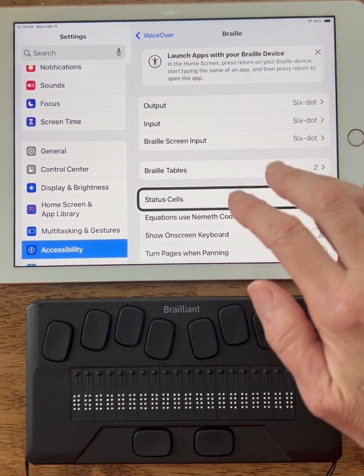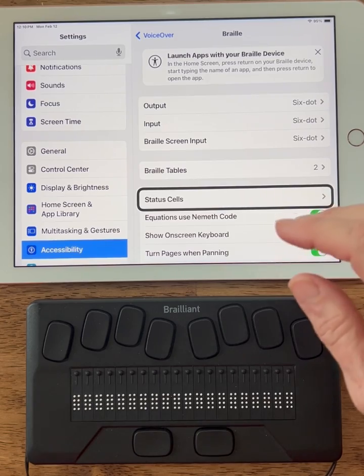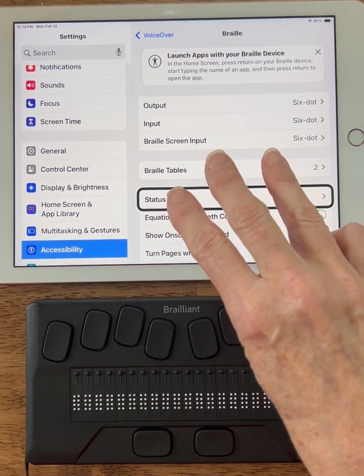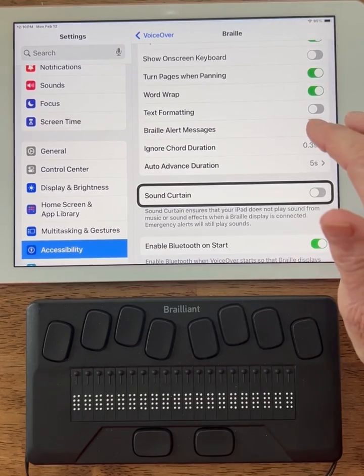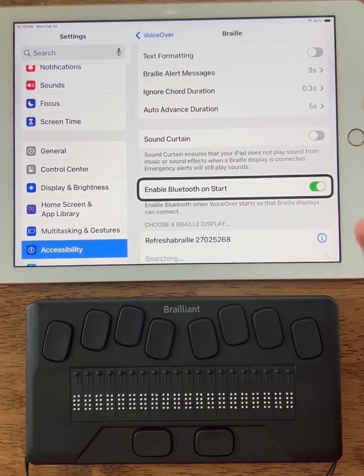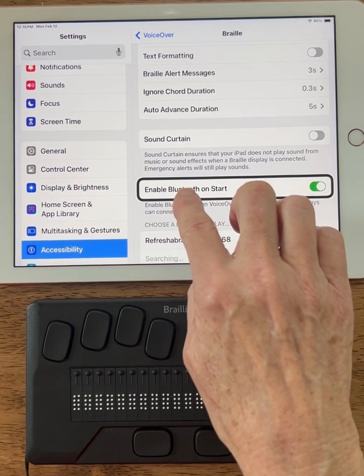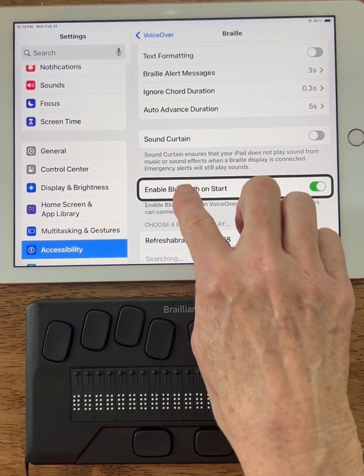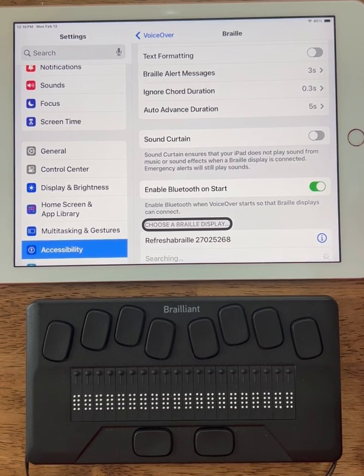The Braille display option is at the bottom of the screen. To scroll down, I'm going to use three fingers and swipe up. Row 6 to 16 of 18... row 9 to 18 of 18. I'm going to drag my finger to find 'Choose a Braille Display.' There it is — that's what I'm looking for.